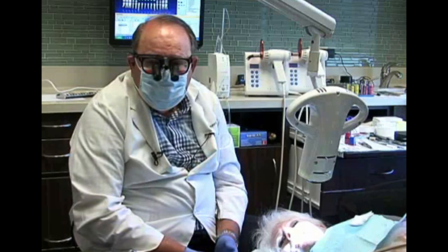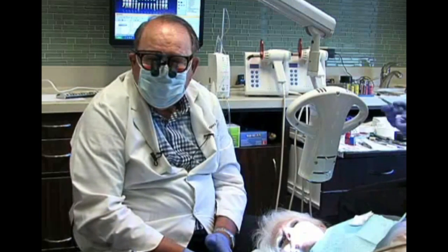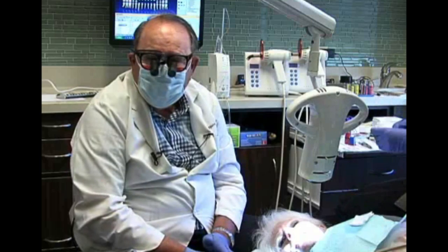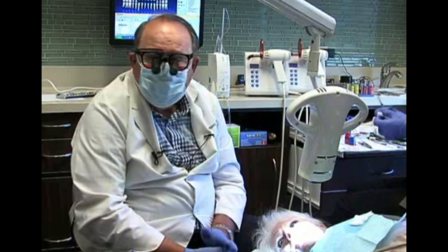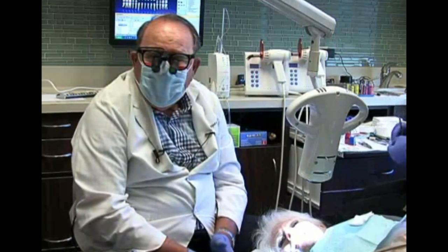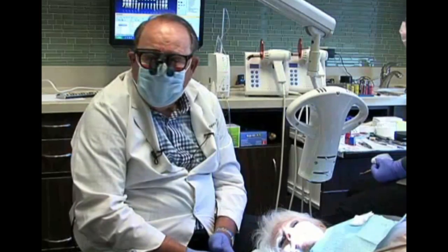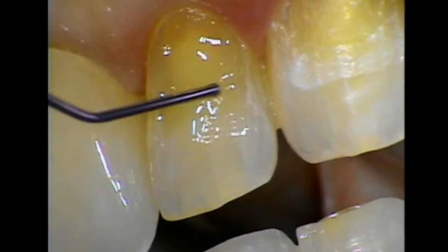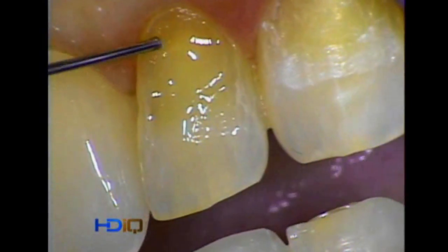Number two, when you're sculpting material you should always be sculpting into the sulcus. When you start, apply it into the sulcus first, not away from the sulcus — that will also help. But the third thing that really helps is I always start with a flowable microfill and underfill it. It's easier to place composite to composite, so we use a very light coat, underfill it, and do it very slowly. We don't need a lot.